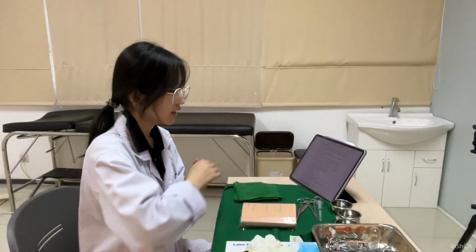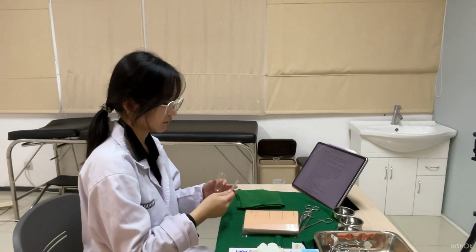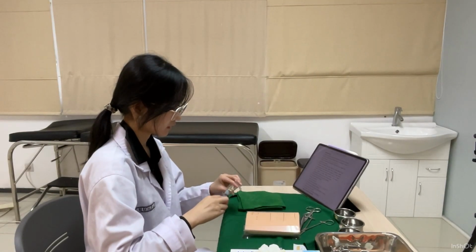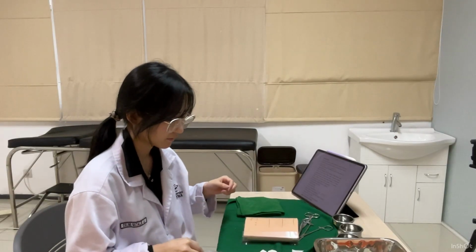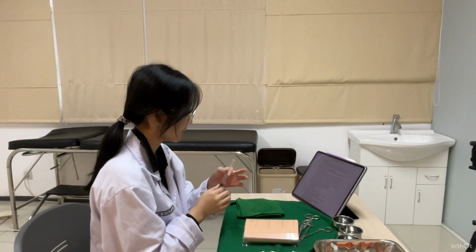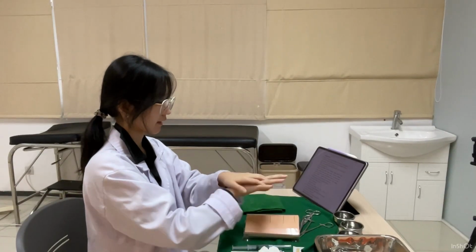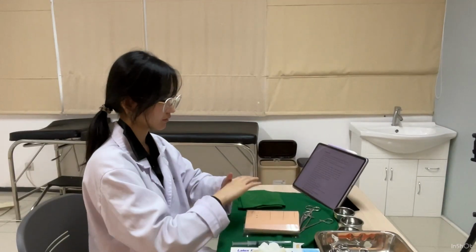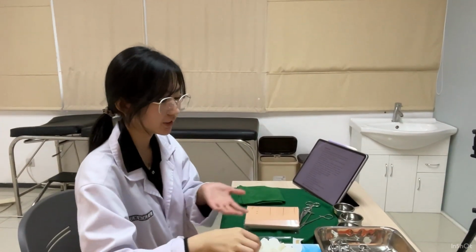Okay, so I will prepare the anesthesia, which is the lidocaine. So I prepared the anesthesia and I will wash my hands now. Okay, next I will wear sterile gloves.